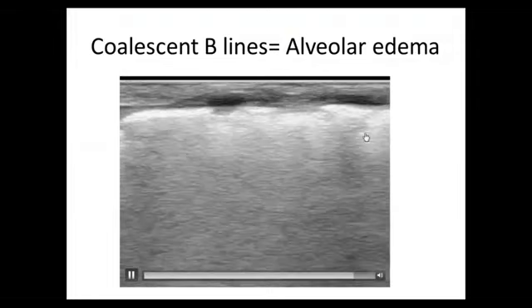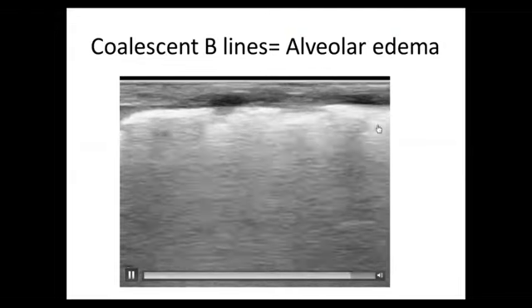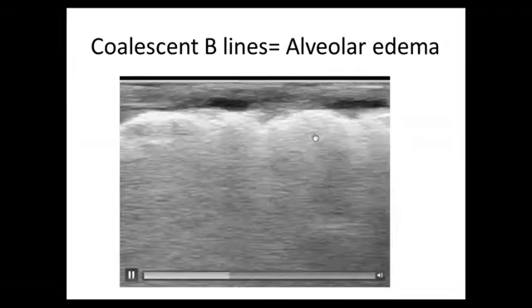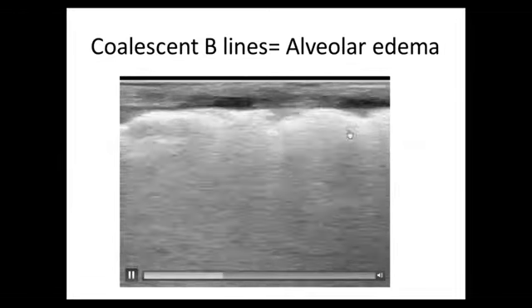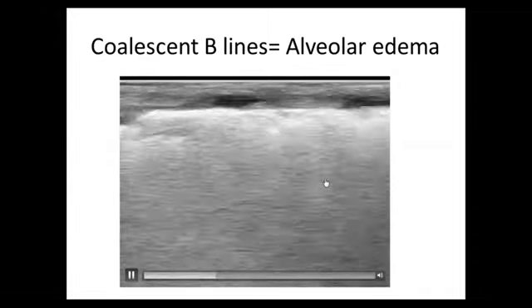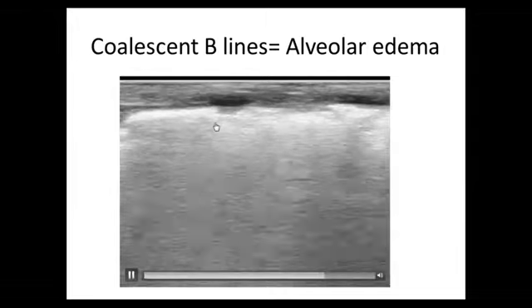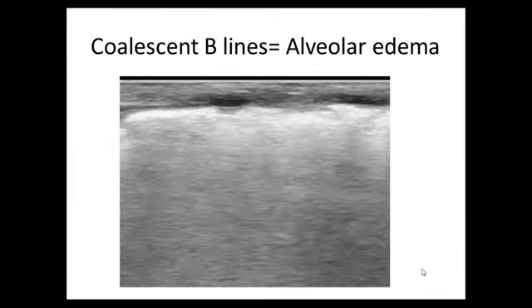which is different from if we have the pleura not well demarcated as before. So the pleura does not appear like a well demarcated echogenic line. It is diffused with what's underneath the pleura as white out. So we have here alveolar edema. You cannot differentiate longitudinal B lines anymore, and everything is just echogenic or bright. So you have a significant amount of fluid in the alveoli, not in the interstitia. So this infant was a significant RDS infant before giving surfactant.